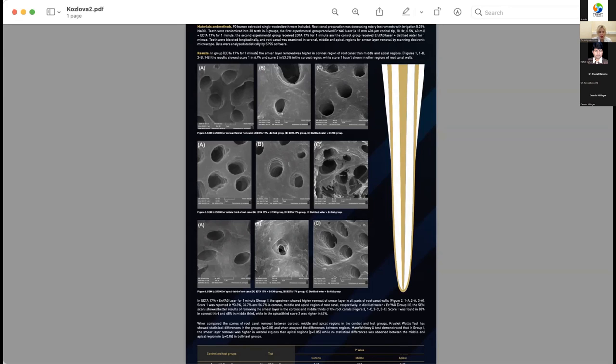Although the smear layer removal in the apical region was less than coronal, this combination has proved its efficiency in creating clean, open dentinal tubules, and that is related to the activation of EDTA solution by the erbium YAG laser, which led to increased efficiency of the cleaning action.